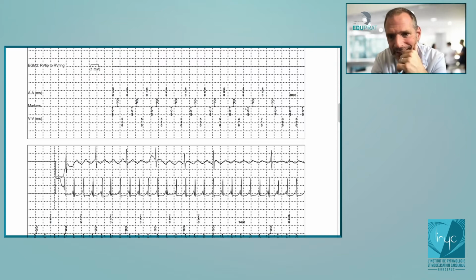And second, with this, you can have some pause, and you know that's of course more important during exercise. The pause can induce the occurrence of ventricular tachycardia. In this patient, we demonstrated 3 episodes of ventricular tachycardia, and every time that was the same phenomenon. Every time that was following a blocked atrial pacing, okay?